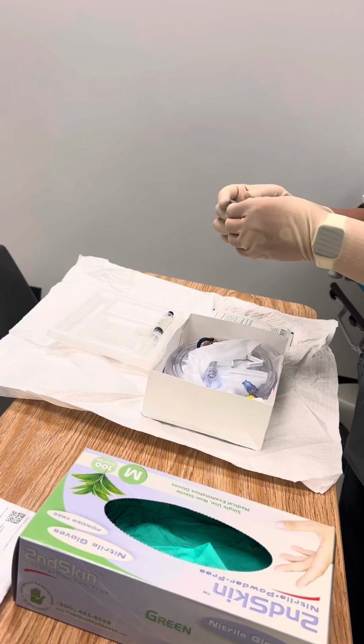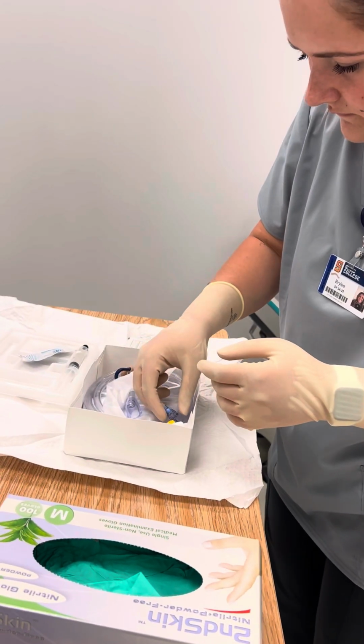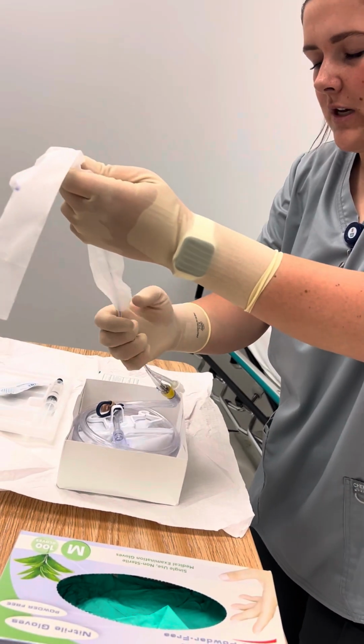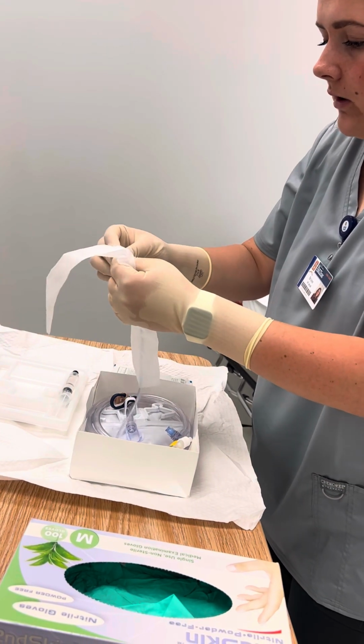The first thing that I'm gonna do is I'm going to lube. I'm gonna put lube on the end of my catheter. I just want to make sure that this doesn't fall around. Let's open my lube first.